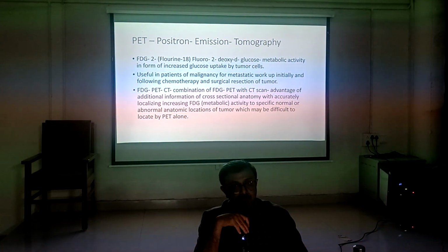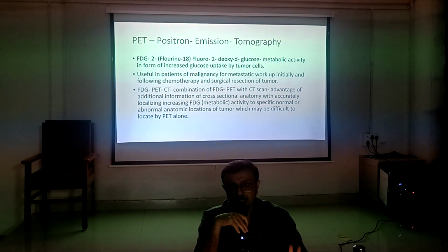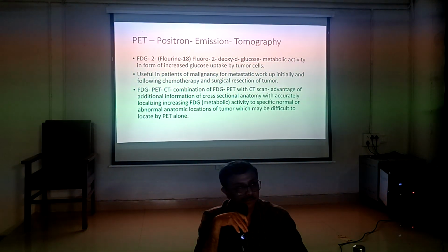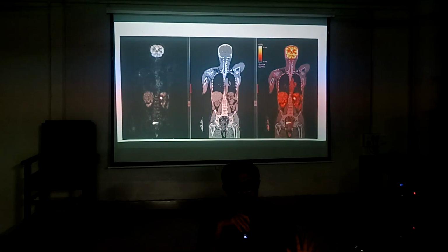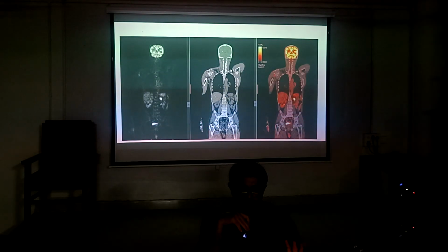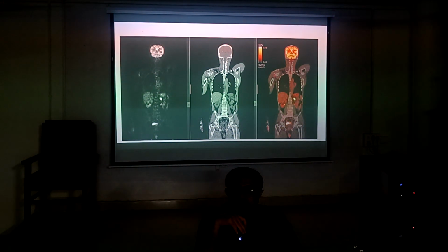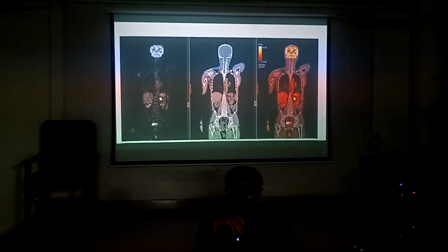Okay. Initially it was not, because of false positive results. If there is inflammation in the body, it will show as a malignancy. Hyperactive zone. We have to find out the hyperactive zone. So that is the site of metastasis. But if it is inflammatory, inflammation again can give you a false positive result. But yes, clinically we can judge it. Definitely.